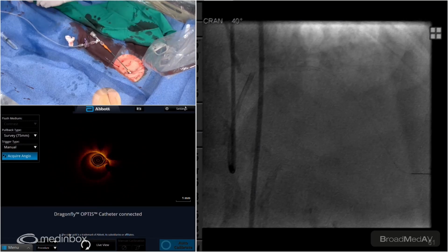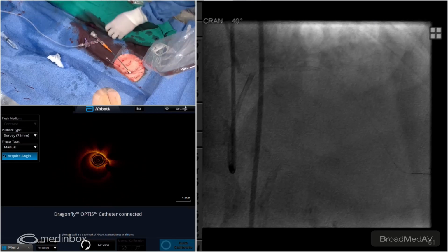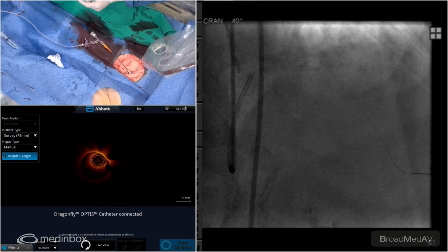Thanks, Jocelyn. I'll take that from you there, Arjun. I'll give this to you here, Sheila. Okay, roll that out. Let's try the OCT back in again, see whether we get some imaging of what we're dealing with. In terms of the nemesis, most of us agree nodularity, especially calcium that's quite nodular, is going to be tough. I don't know what your experiences have been, Malik. What would be your go-to device if you had nodules?